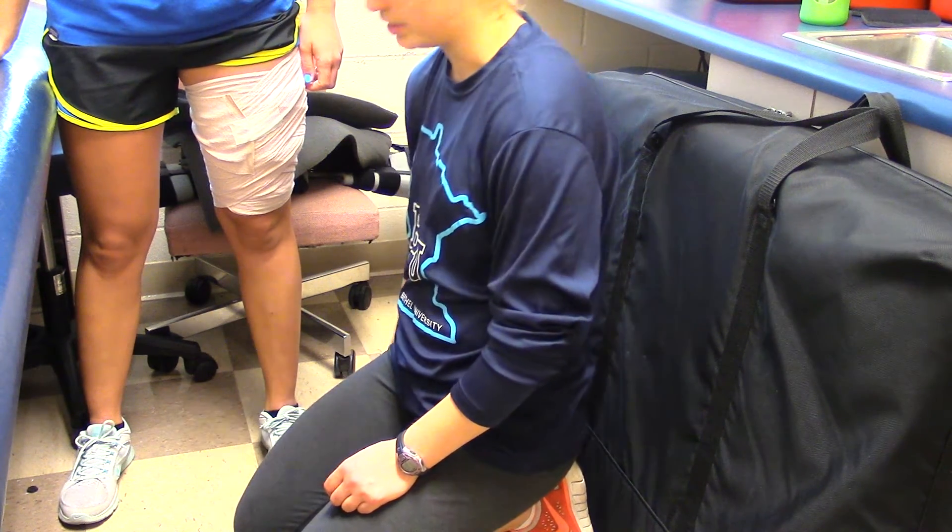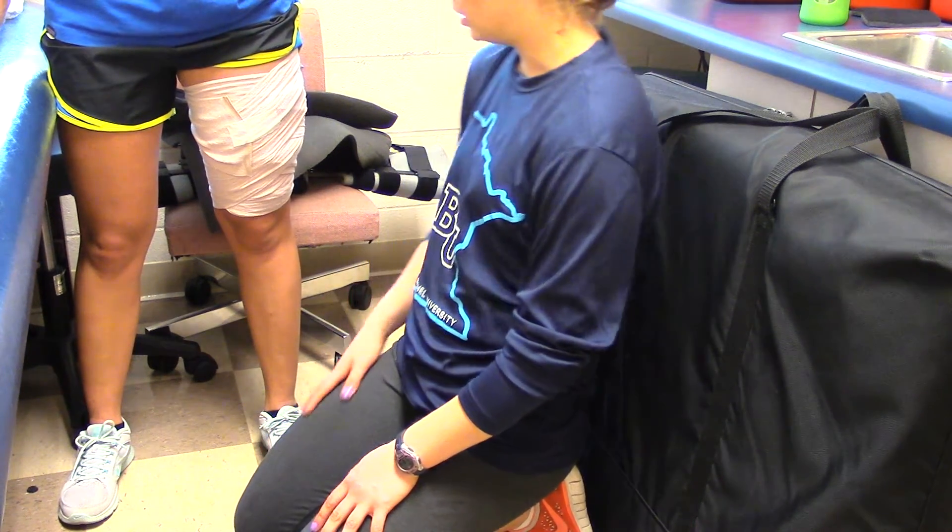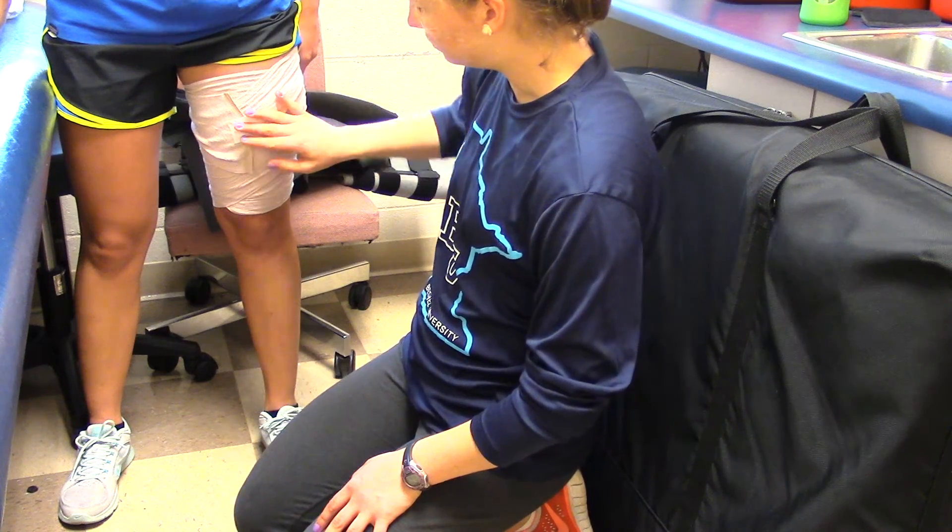We'll just make sure her foot has good circulation, make sure her blood is still flowing through her legs so it's not too tight. Not too loose, not too tight, no gaps. So there you have it.